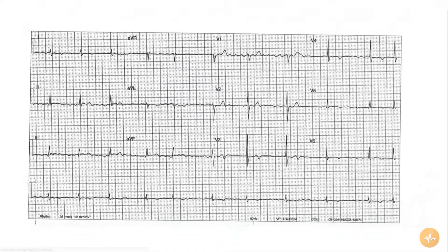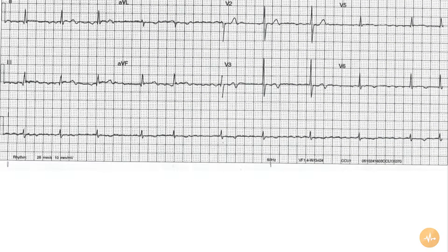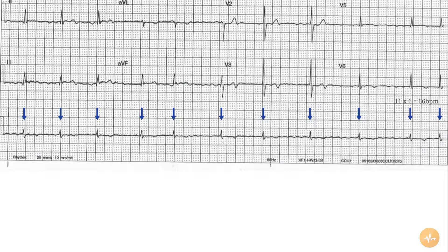The rate is 66 beats per minute. The rhythm is atrial fibrillation. The rhythm is clearly chaotic, i.e. irregularly irregular, with fibrillation waves seen on the baseline.